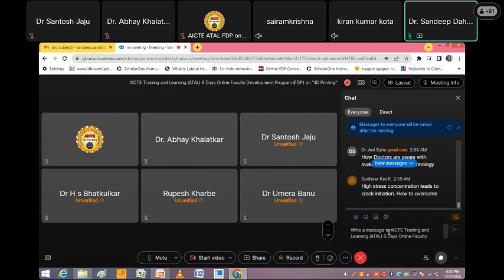So in that case, you have to learn specialized software like Mimics and 3-matic. We also have Geomagic Freeform software, which is equivalent to 3-matic. 3-matic is very good software, but some tools in Freeform are very good. So you must know 3-matic and Geomagic Freeform also.